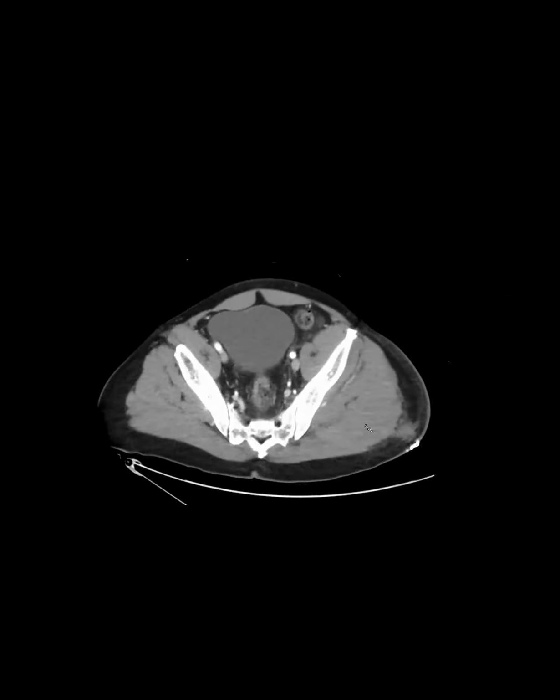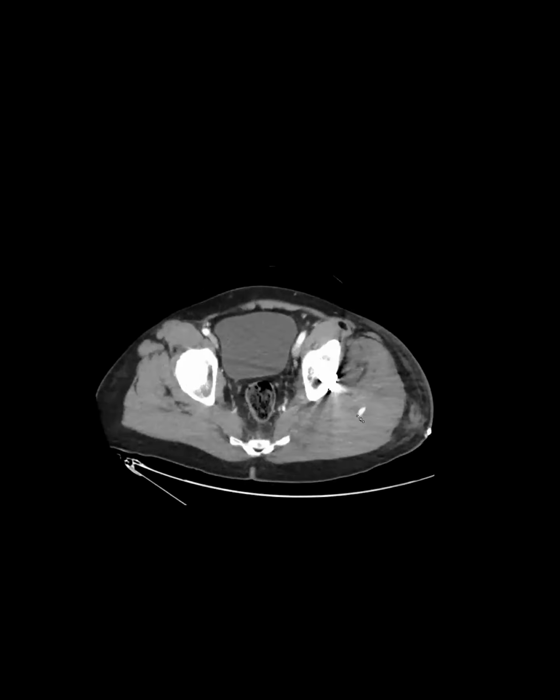But anyway, take home point: if you see a hematoma, look carefully. If you're concerned, like this could be a bone fragment, it would have been more ideal to have the non-con first. On the CTA, make sure you get the non-con first too, and call the team.